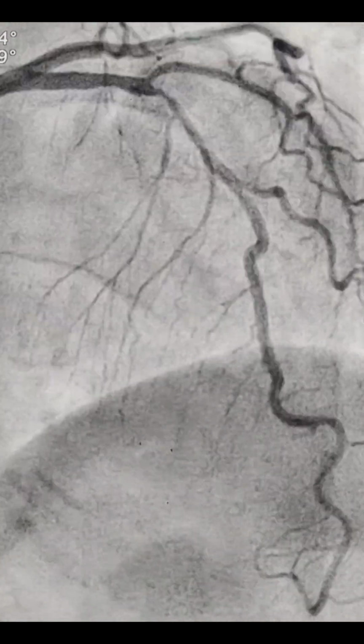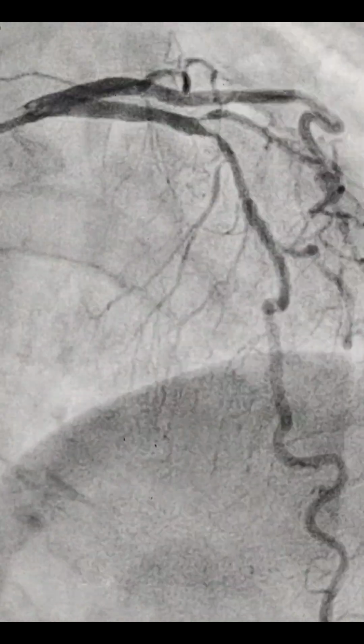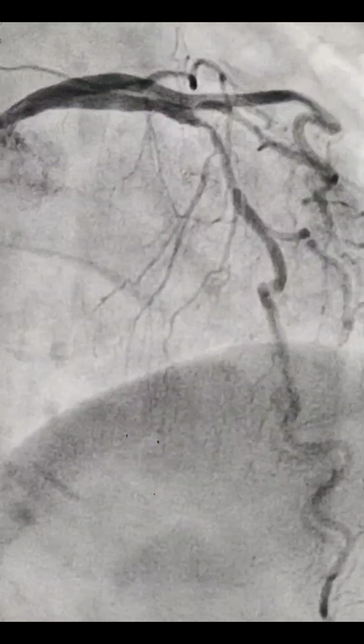This is a 61-year-old female, a known case of hypertension, here to rule out any CAD. The troponin was negative. On ECG, there was a mild ST depression in the anterior leads, and TMT was positive.